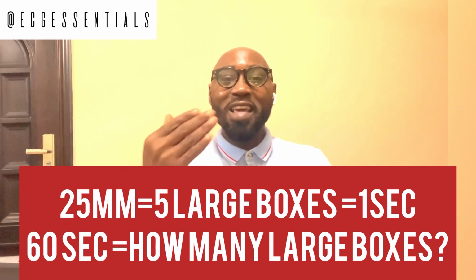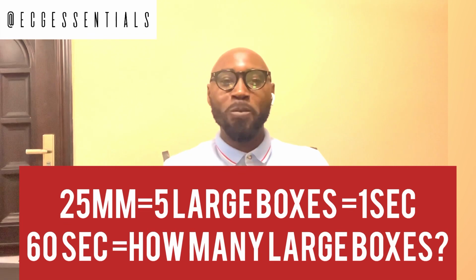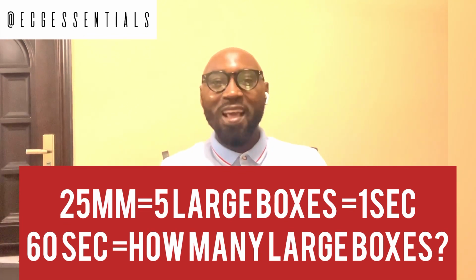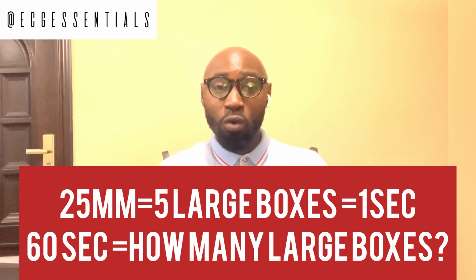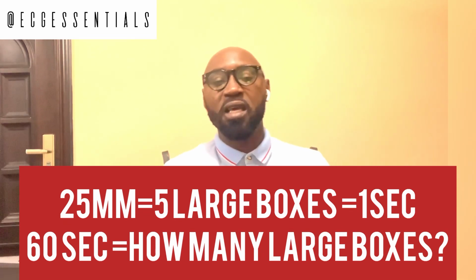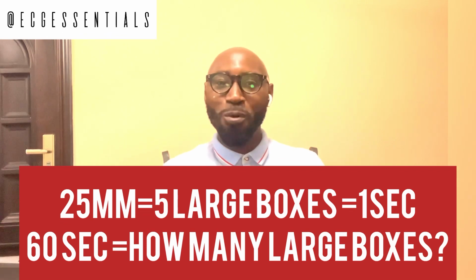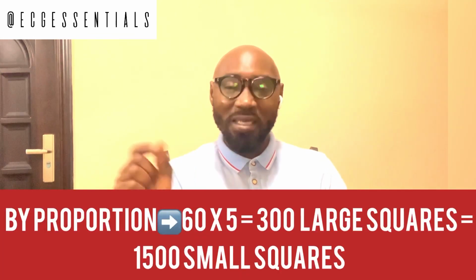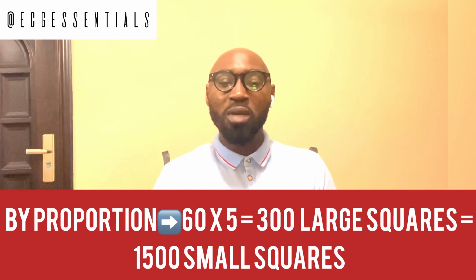So if 5 large boxes will be printed on every second, then the question we ask is how many of these large boxes would have been printed on over a period of 60 seconds, that is over a period of 1 minute, during which we are checking the pulse rate. So by simple proportion again, all we do is multiply this 60 by the 5, arriving at 300 large boxes.